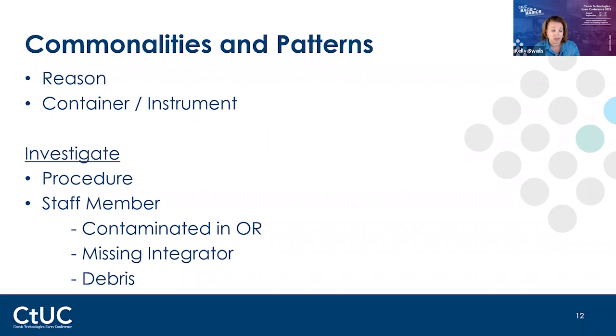Simple education. I used to tell people, the minute you set your container on your workstation, grab your chemical integrators and put them right there with your instruments. So then they're there, and as you put everything in and your last instrument goes in, you still have chemical integrators, and now you put those in. So just educating and working and giving them some helpful hints.